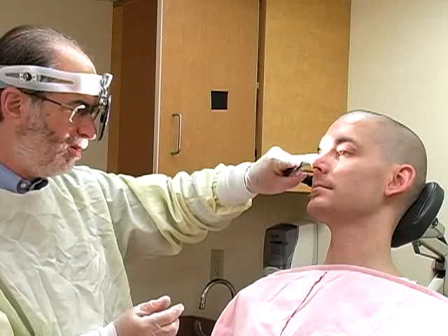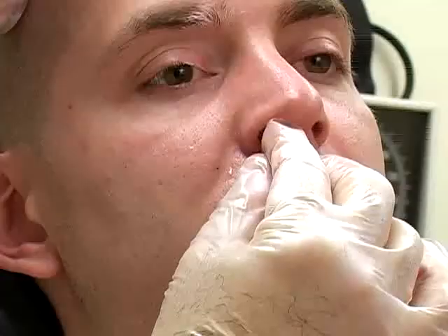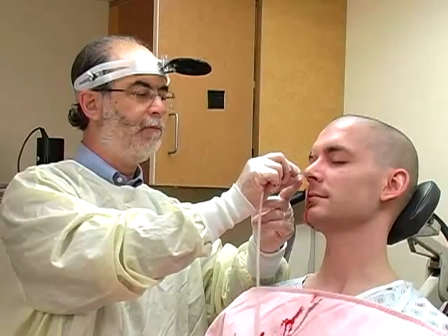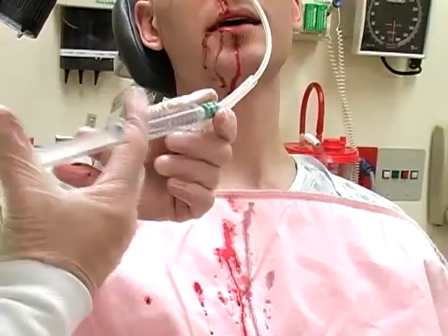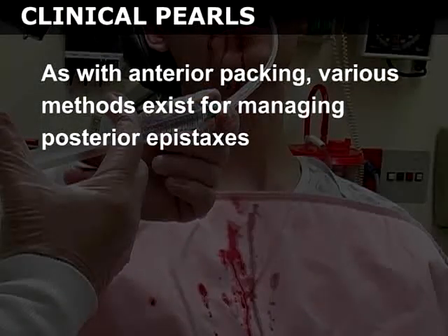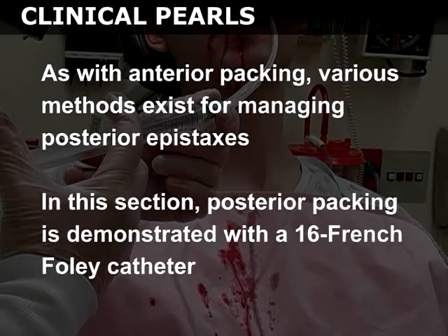If bleeding cannot be localized anteriorly, or if it cannot be controlled with anterior packing, then a posterior epistaxis likely exists, and posterior packing is indicated. As with anterior nasal packing, various methods exist for managing posterior epistaxis. In this section, posterior packing is demonstrated with the readily available 16 French Foley catheter.